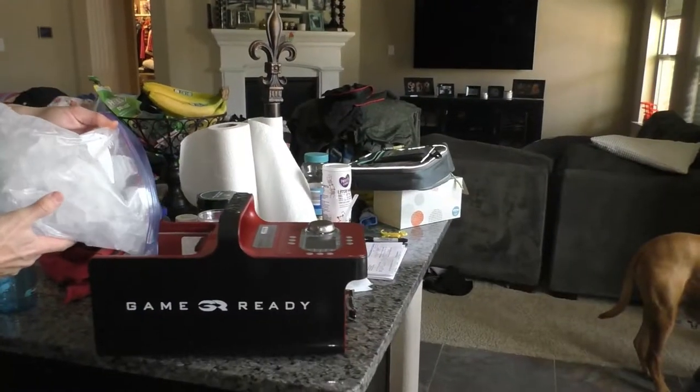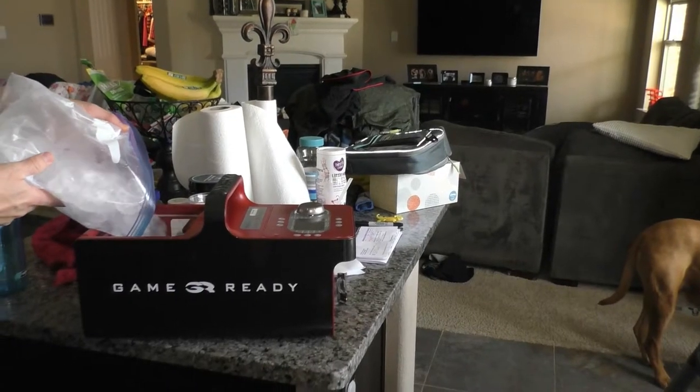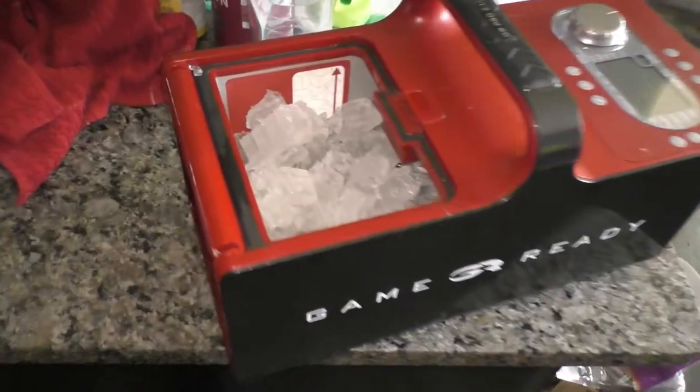After that, you pour in the ice. I like to pour it all the way to the top so I can use it several times throughout the day.